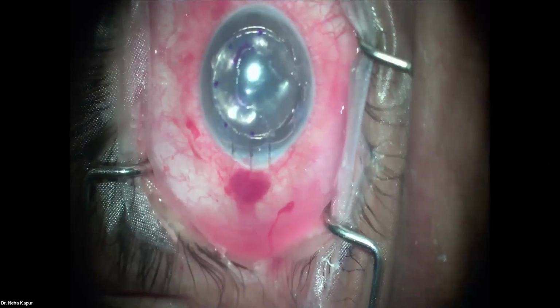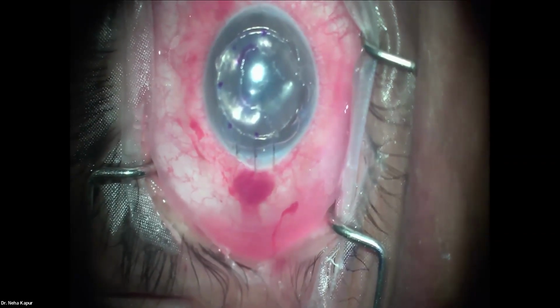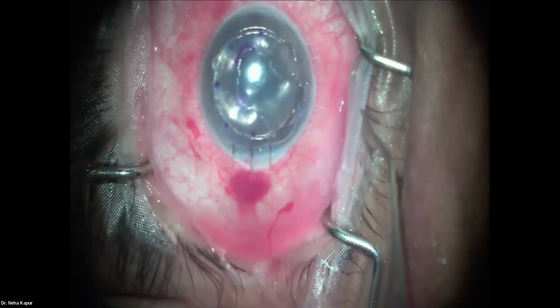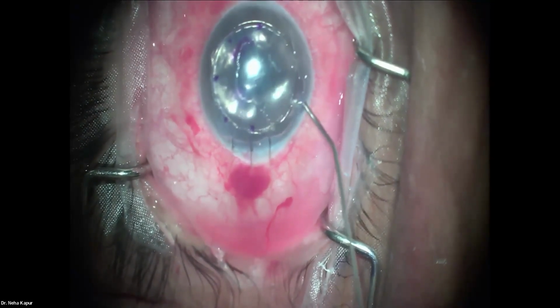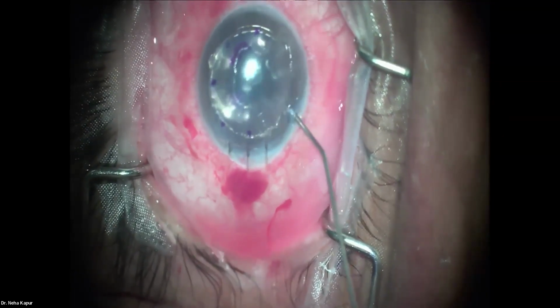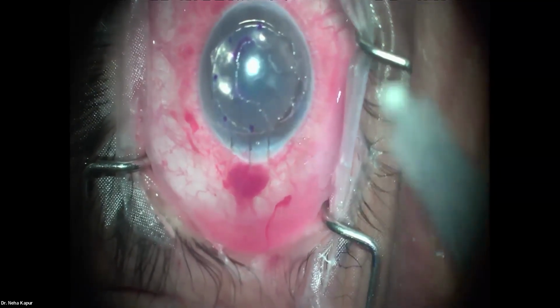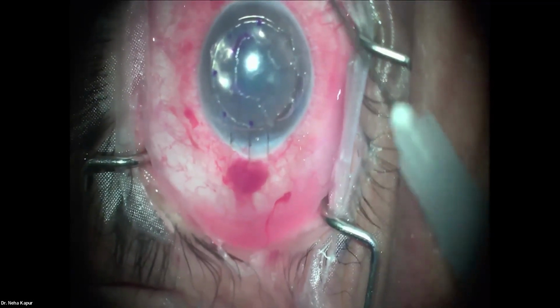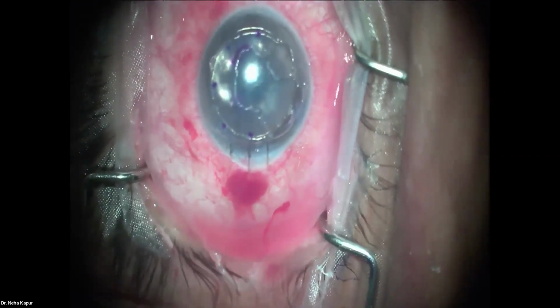I think the eye is fairly tight and the lenticule is fairly well stuck. Just in the end, we'll reduce the air bubble a little to have a little clear meniscus. And it's good to not take out air, but replace some of it with fluid. And now there is a clear meniscus that we have. The eye is not very tight.